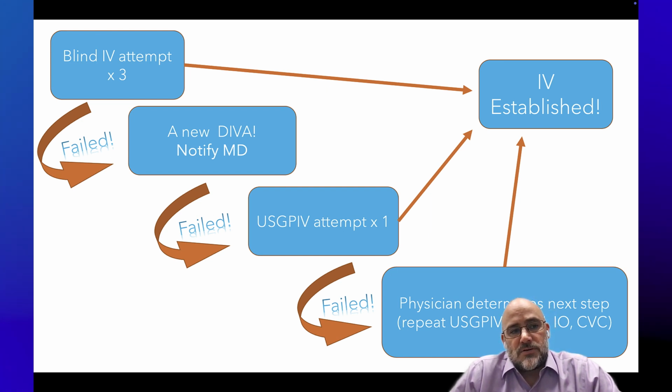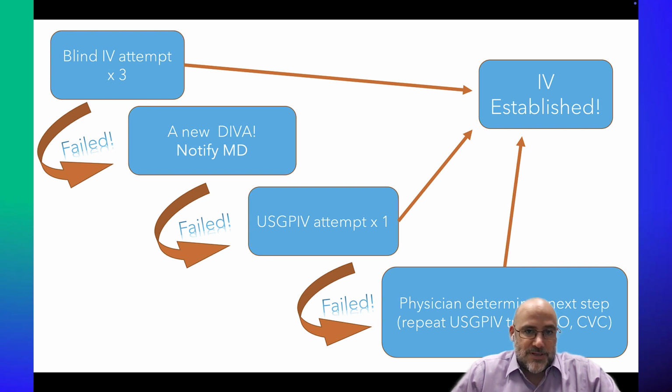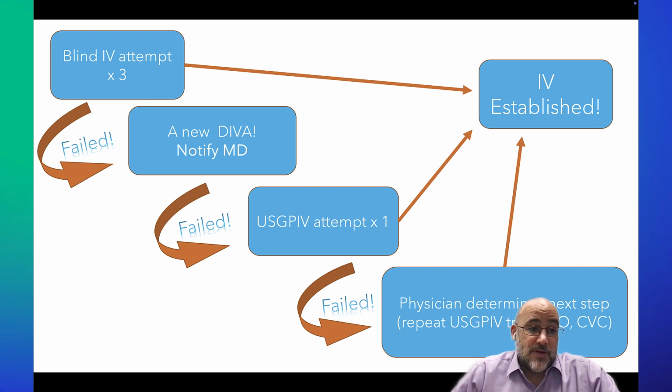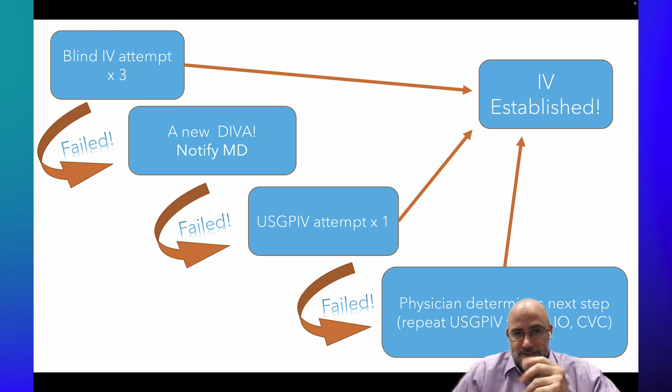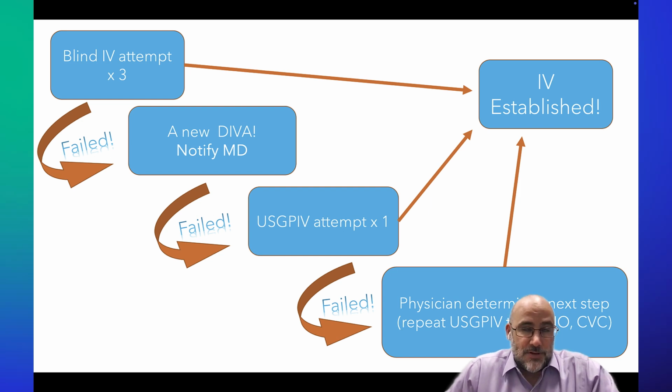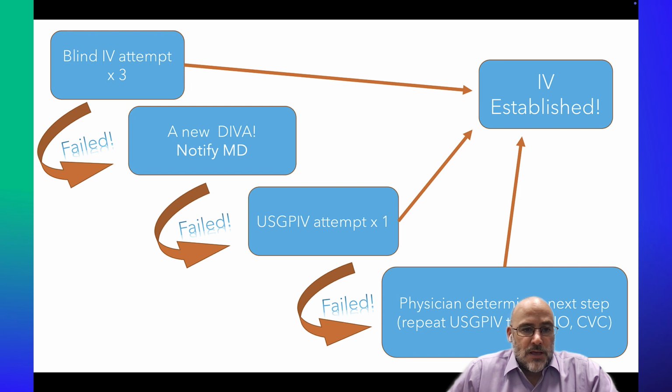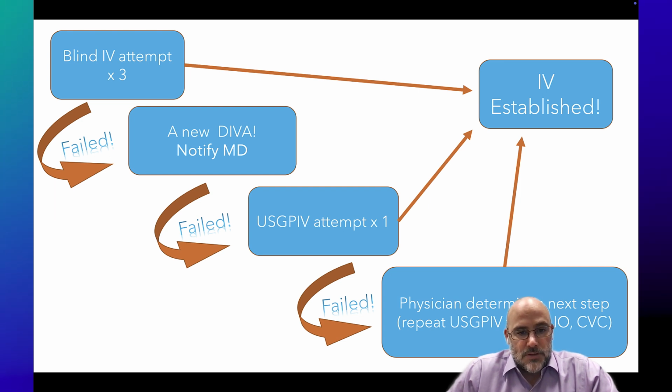Okay, so in general, this is what we're looking at. Blind attempt times 3, or whatever the standard is. If the patient says no, you need an ultrasound, go ahead and listen to them. It's fair enough. But essentially, it's failed. So you've got a new DIVA. You notify the doctor. Put this in here for situations where you're working relatively closely with the physician, such as in the emergency department. But you can establish the protocol or whatever the process is on the floor. It's fine. So the new DIVA: try an ultrasound guided stick. That sounds great.